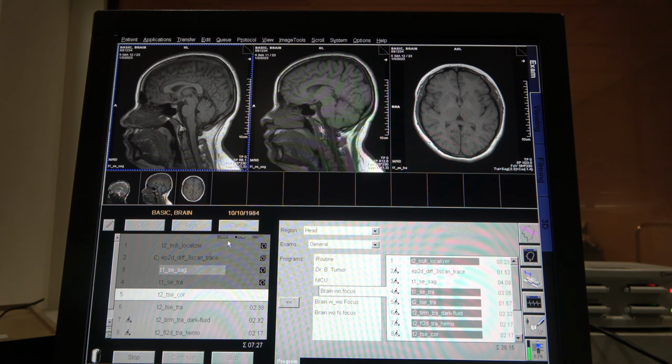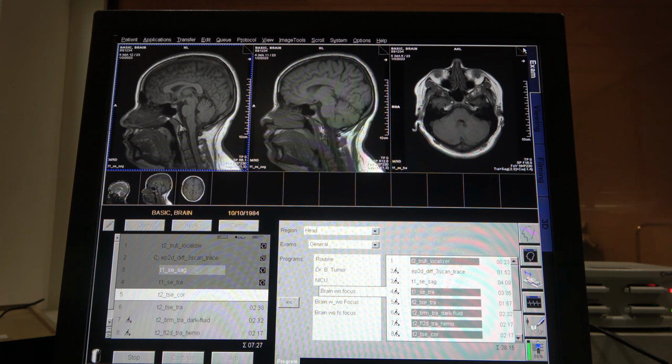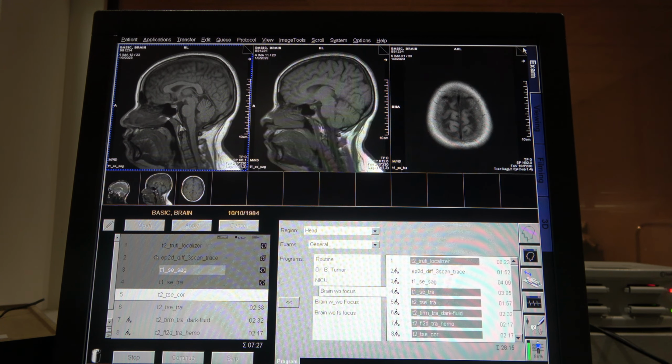All right, so I'm gonna warn the patient that she has 2 more minutes. Young lady, you got about 2 more minutes. Okay, 2 minutes. All right, this is our axial here. Very nice. Very nice.